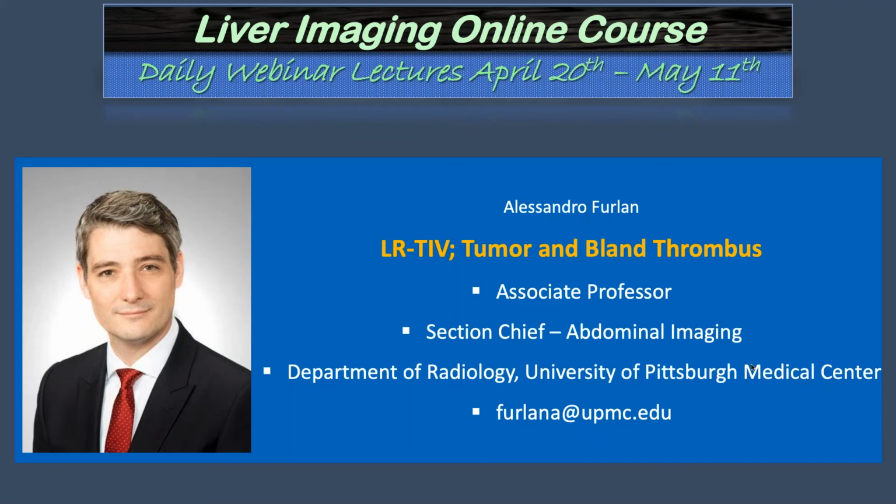Unfortunately, those patients may not have a shot at liver transplant just because of the infiltrative nature and extension of the tumor to start with. But again, if you don't strongly recognize that enhancement in the vein, you can suggest it without being definitive. In those cases, it's also challenging to categorize that diffuse and infiltrative type HCC.